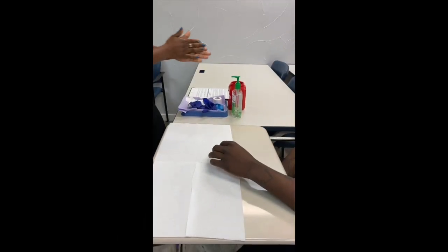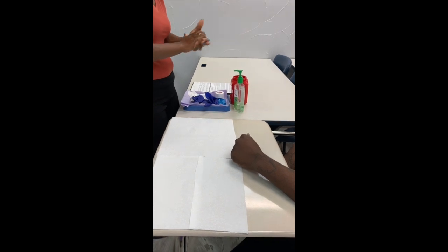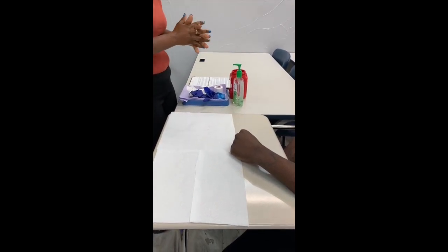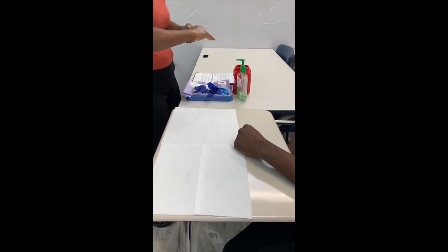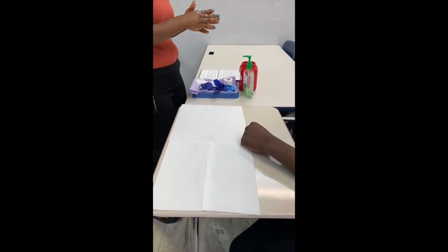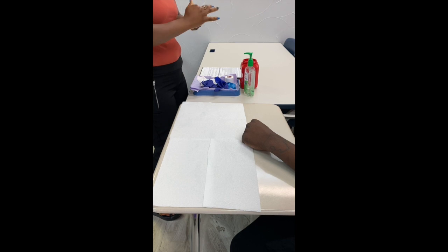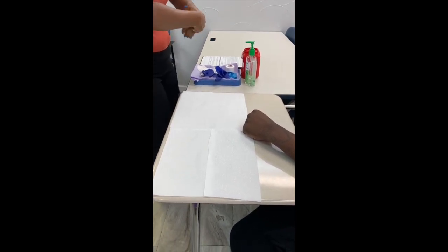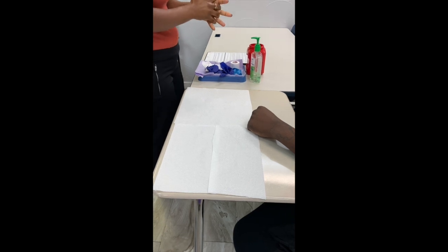I'm going to get my hand sanitizer and make sure that I cover all surfaces of my hands, in between my fingers, my wrists, and also don't forget your fingernails. A lot of people forget to scrub those fingernails, and they also forget to get the thumbs. Make sure that you rub until they are dry — you don't want to air dry or fan them in the air. There may be a risk of fomites, dust particles, and bacteria.